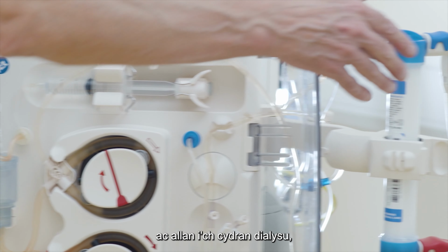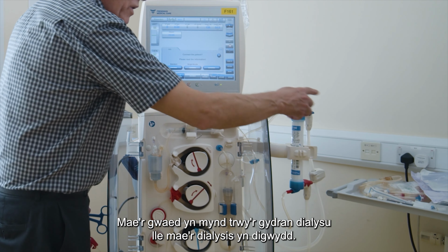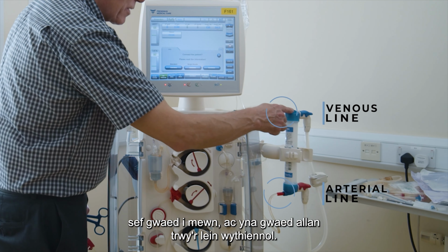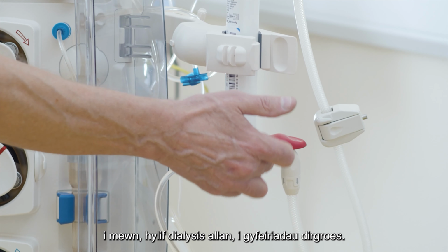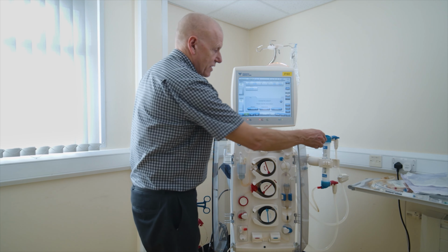and out to your dialyzer. The blood passes through the dialyzer where dialysis takes place. You have on the dialyzer the arterial line, blood in, and then the blood out through the venous line, and you have the dialysis fluid lines, dialysis fluid in, dialysis fluid out. They're in opposite directions. It's called contraflow.